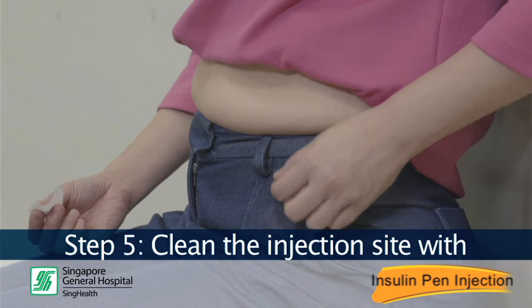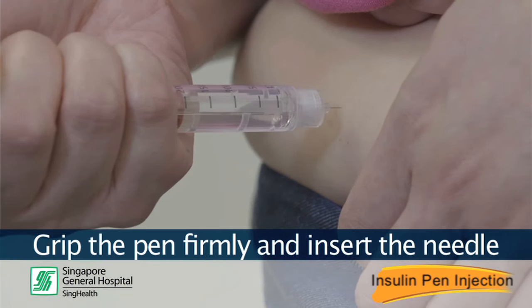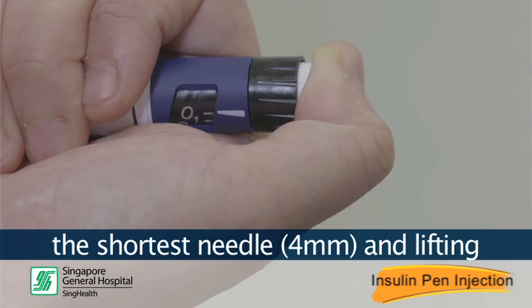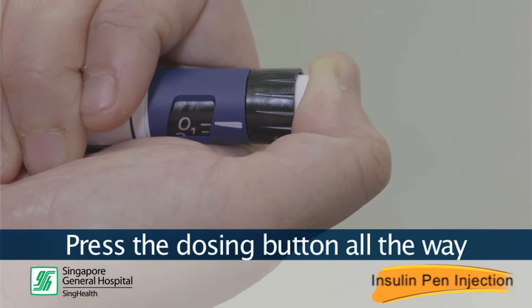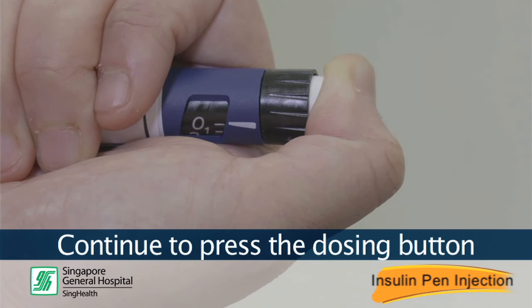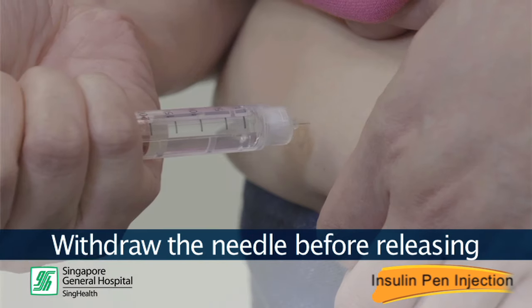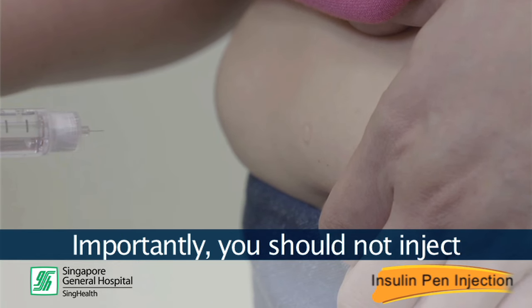Let's try to do the injection now. Step 5. Clean the injection site with an alcohol swab and allow it to dry. Grip the pen firmly and insert the needle perpendicularly into the skin. Inject the insulin slowly. Lean people should consider using the shortest needle and lifting a skin fold for injection. Press the dosing button all the way until the marking zero lines up with the pointer. Continue to press the dosing button and start counting slowly to 10. This is to ensure you have received the full dose of insulin. Withdraw the needle before releasing the skin fold if applicable. Importantly, you should not inject through clothing.